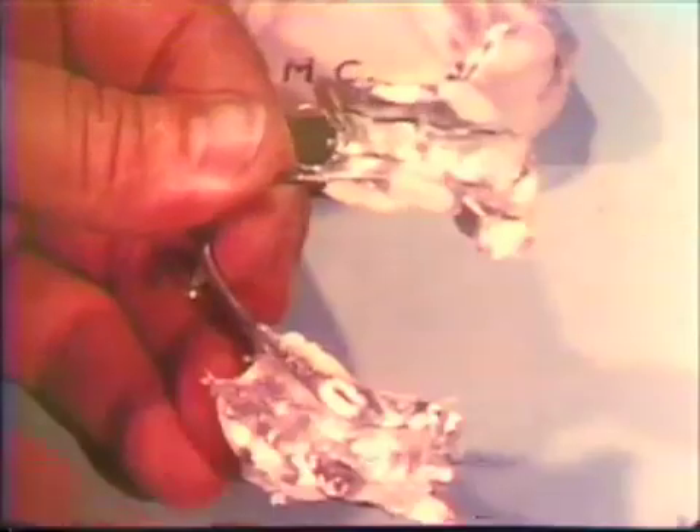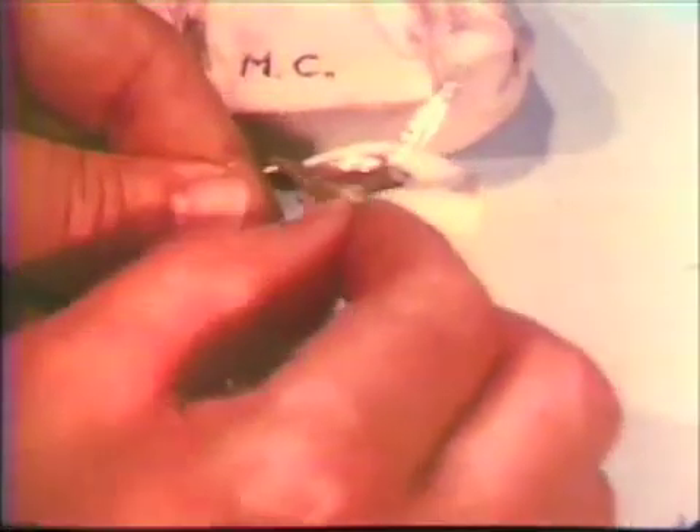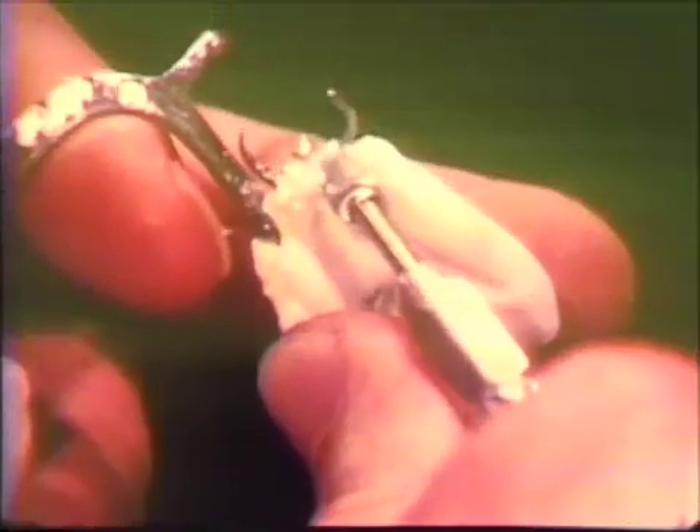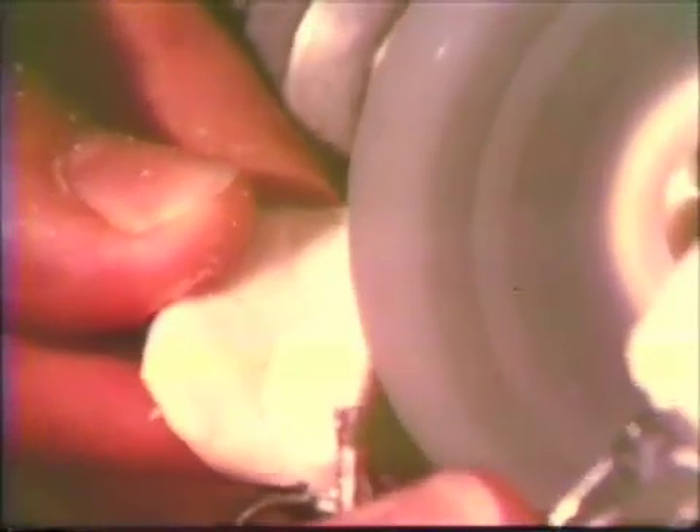The appliance with the temporary bases is gently removed from the master cast. The foil is removed and the resin trimmed from the area of the abutment teeth. The anterior aspect of the buccal flange is trimmed to free the retentive clasp. The remaining excess of acrylic is contoured to reproduce the anatomic outline obtained in the impression. Care must be exercised when using the laboratory lathe to prevent trapping or binding any unit of the framework during this procedure.